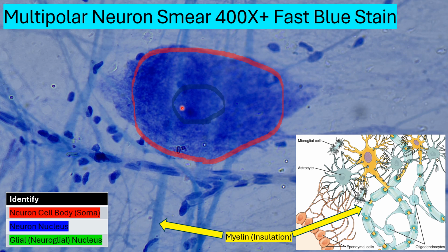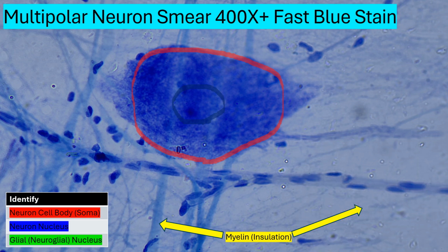And it kind of blends in with the nucleus, makes it a little bit harder to see. Then we also have the beginnings of our neuronal cell processes here. There's at least 3 good ones. So you can see where the fibers continue on beyond those processes. And then we have multiple glial cell nuclei. Those are all of these smaller staining circles.